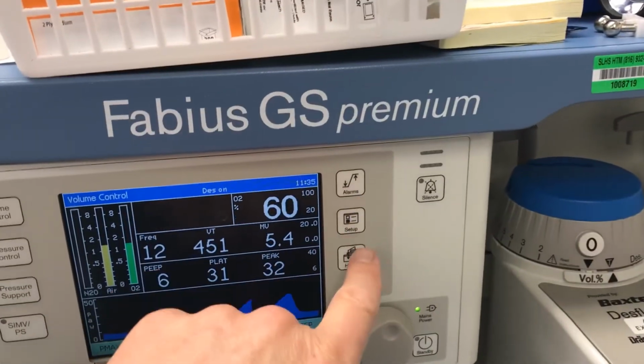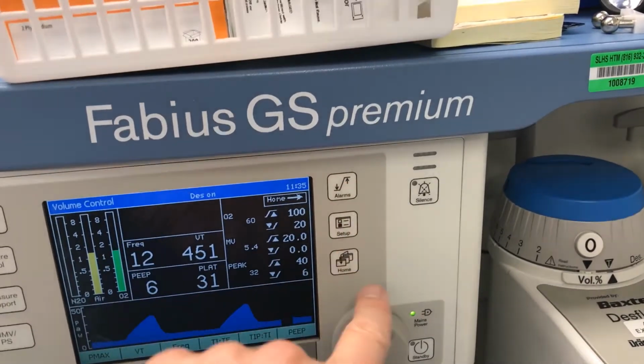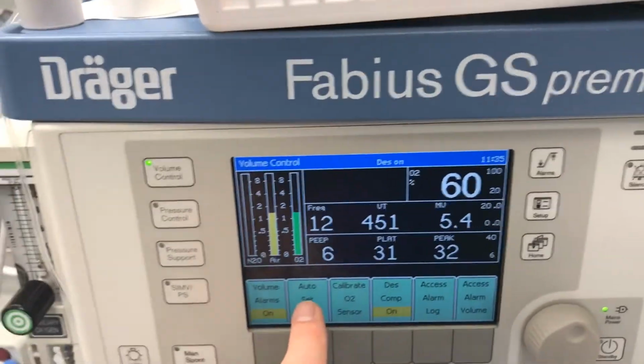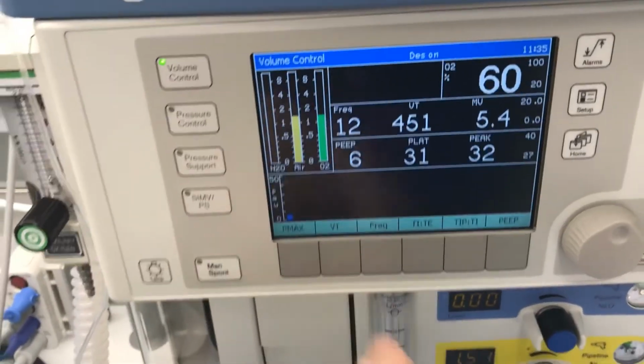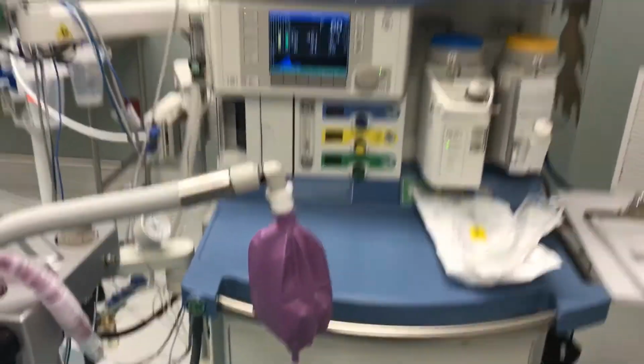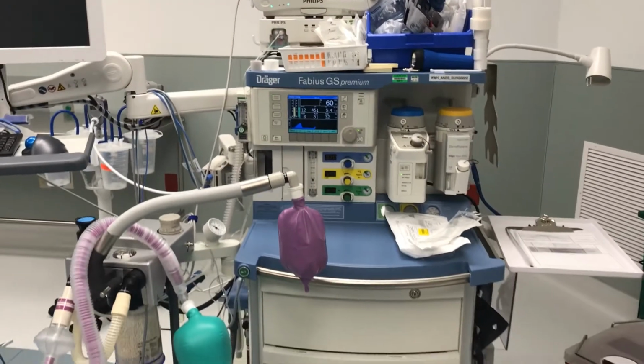We have alarms. Every once in a while, if you do get an auto PEEP alarm, the best way to fix that is press this auto set, and it resolves that very quickly. Otherwise, the overall function of the machines are very, very similar.